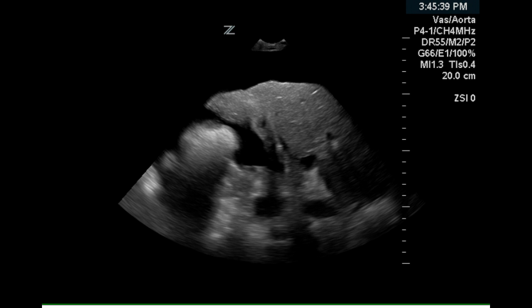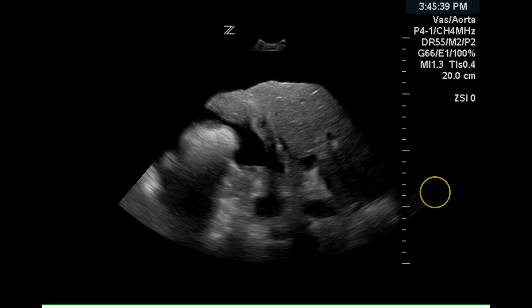Another image of the liver indicates nodularity and increased echogenicity. The liver also appears small in size. The spleen was not measured in this examination. The images demonstrate an echogenic liver of reduced size with a nodular hepatic capsule, consistent with cirrhosis of the liver.